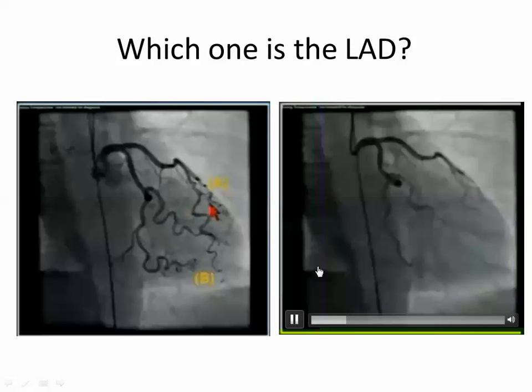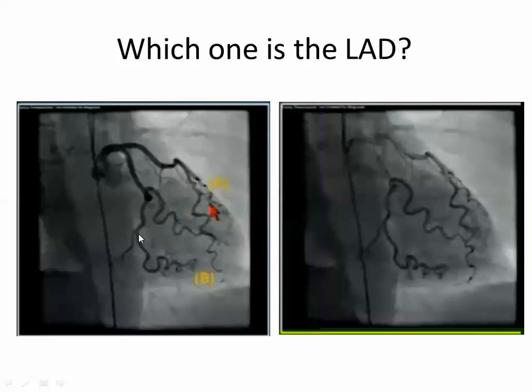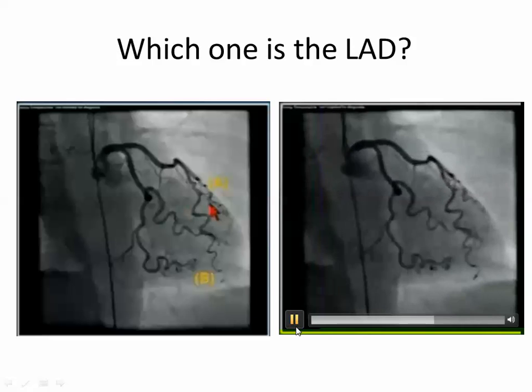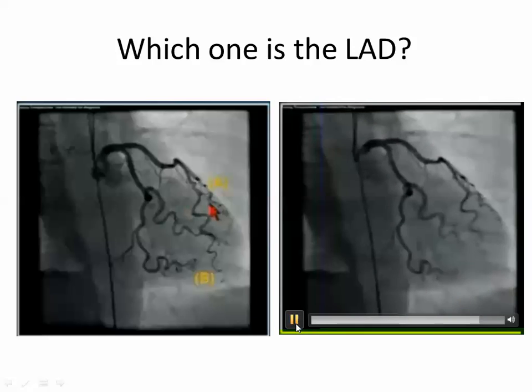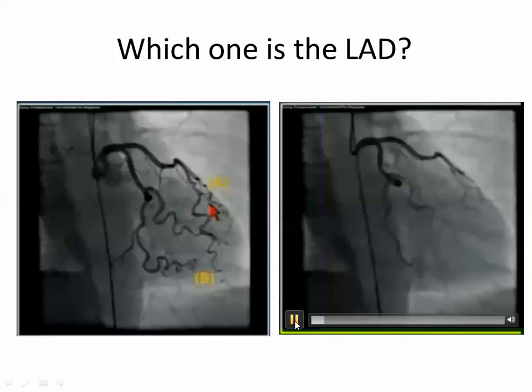We stopped here. Which is the LAD? Is it this vessel, this, or this? See the movie. The vessel is this. Why? Yes, anterior.